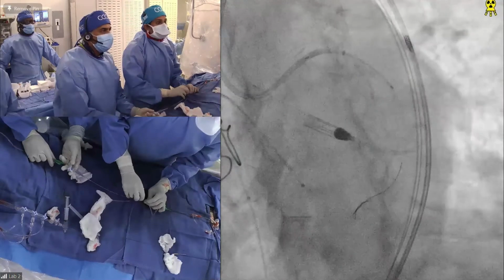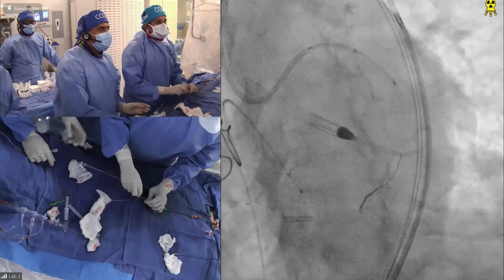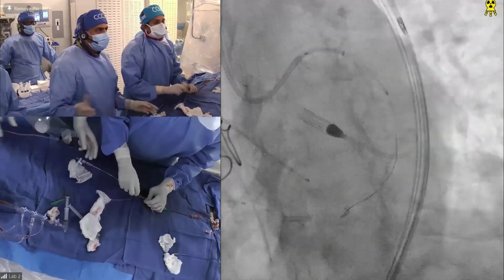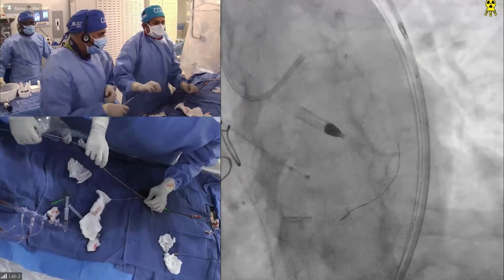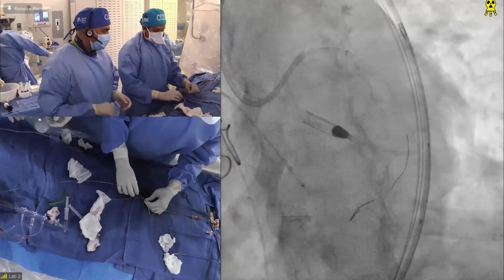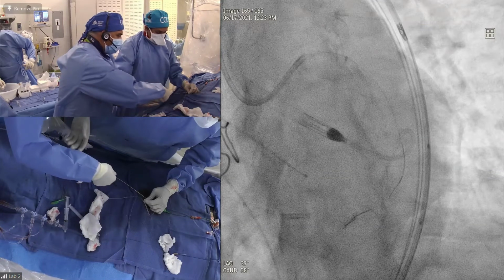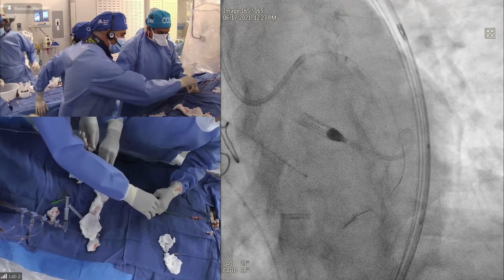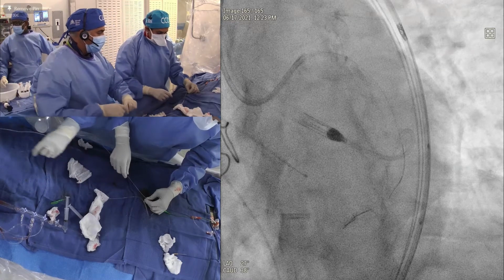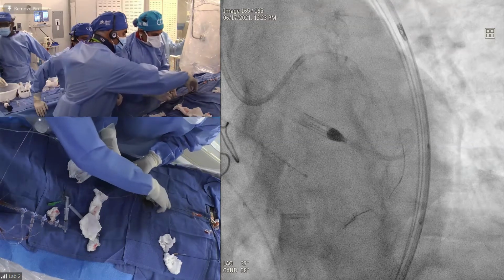So, which is the next step, Antonio? Are you happy with this? With this, you see the guideliner. What would you have done? Anything different? I think she's still having a hard time. I think 2.5 high pressure, I would have done the same. As was mentioned, maybe after the 1.25, I almost always go with a 1.5. But the result is good. I think in this lesion, the dissection is expected. Substantial. It's a big dissection, but it's not malignant. Not a big deal. No, it's okay.